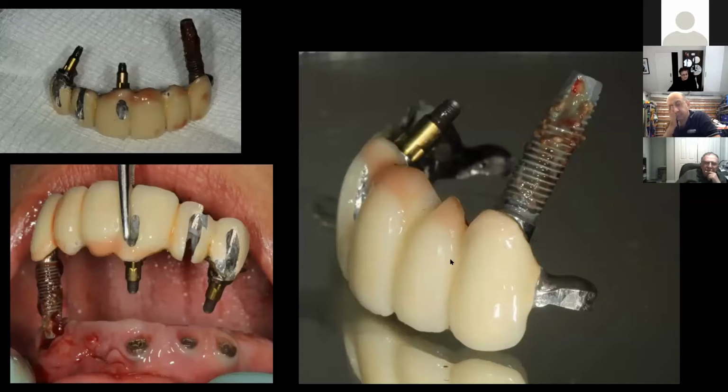I mean, I remember once I did an implant dentistry surgery. I wasn't happy with it, and I couldn't sleep at night. I rang him next day, I said, can you come back? And I just removed the implant and repositioned it, and I could sleep well. And it's been fine for the last 15 years, but I just couldn't do this. You know, someone could do this, and there's not a failed implant here that's coming out.